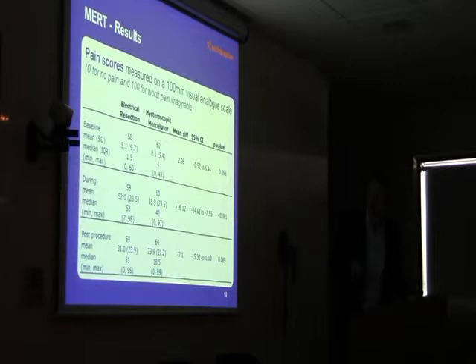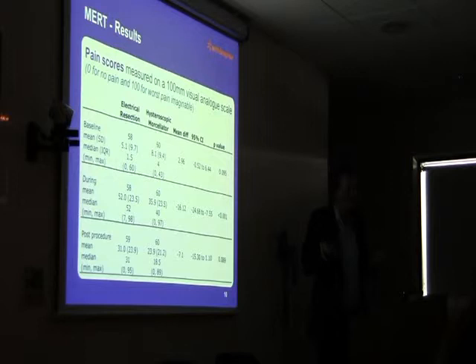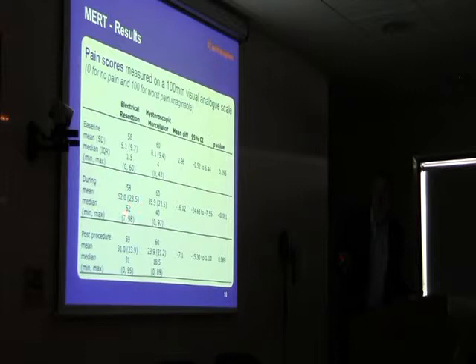So we looked at pain scores. For the baseline pain score, we just asked women how much pain they've got now. Some of the women were 8 millimetres out of 100 in pain before we started. It was just to make sure the groups were balanced. But during the procedure, the mean pain scores were 52 millimetres, so about 5 centimetres, versus 4 centimetres with the morcellator, which was statistically significant. Whether that's clinically significant is hard to say, and you'd have to decide. But certainly there was a statistical difference in pain score. Post-procedure, they were pretty similar.